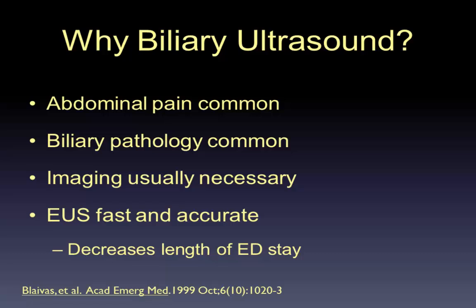But luckily, with a little bit of practice, a little bit of training, emergency ultrasound at the bedside is pretty quick and accurate, two of my favorite words, and we can actually decrease the length of stay and get patients treatment a little bit quicker by doing this at the bedside ourselves, and that usually makes my chair, my medical director, and hospital administrators all happy.